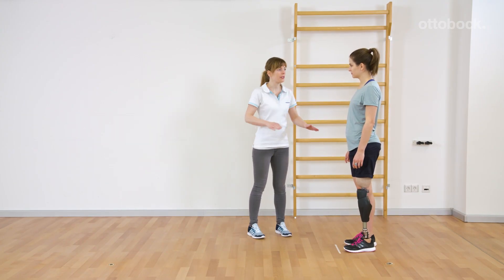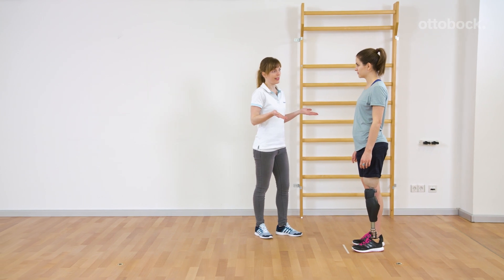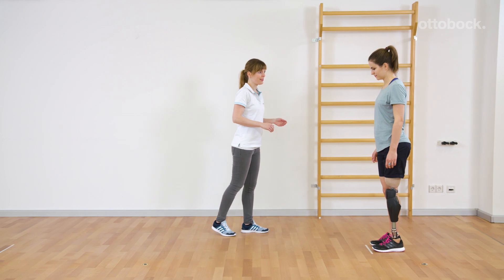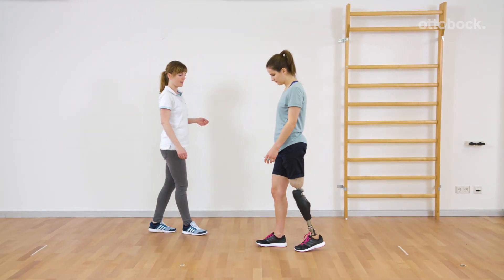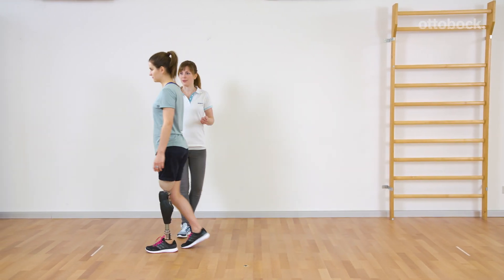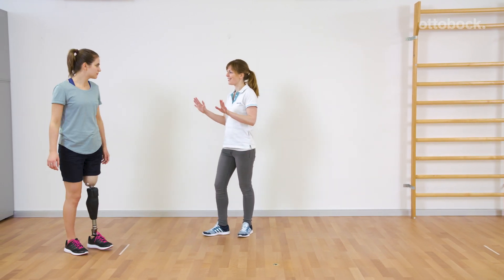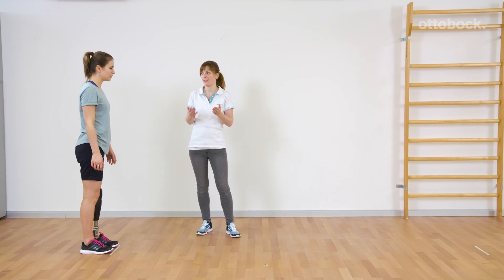Walking with small steps requires balance and technique. Within a defined distance, Reka tries to take as many steps as possible with minimum effort. Franziska counts the steps with successful stance release. With every heat, the number of steps should be increased.